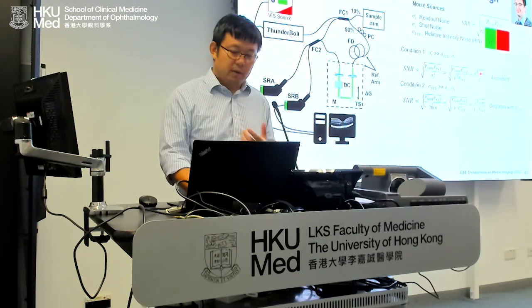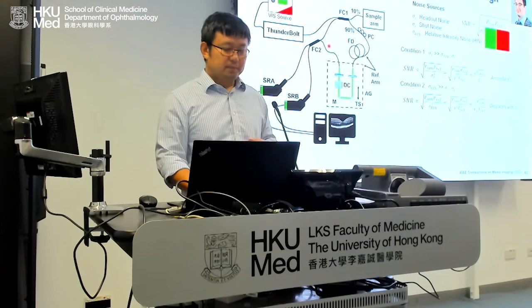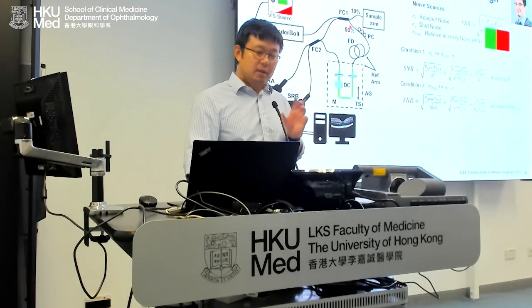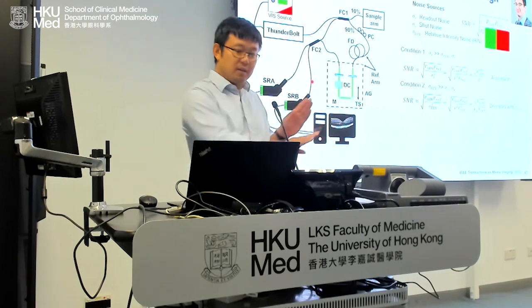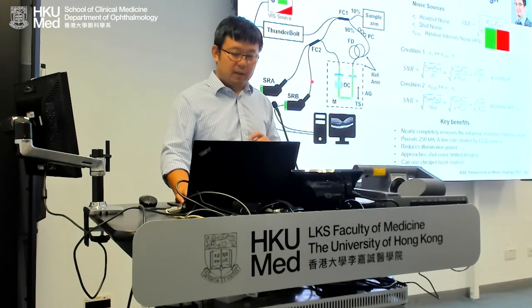Again, Ian made a great contribution to design a new OCT. So of course we had to patent that. The whole OCT structure is not a Michelson anymore. It's a Michelson plus a Mach-Zehnder, using two spectrometers to cancel each other. There's lots of math behind it, but it's very effective.